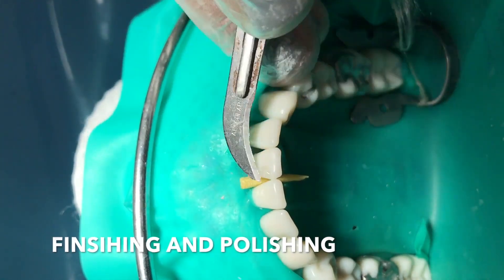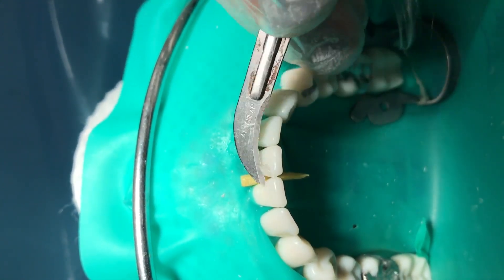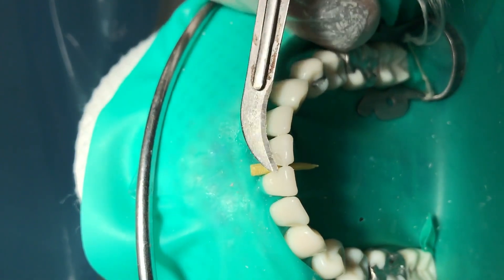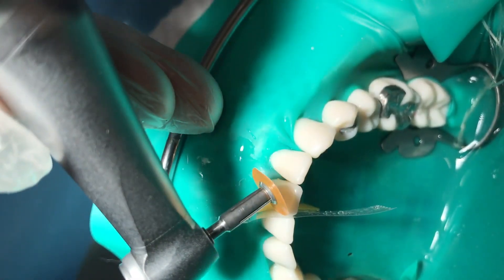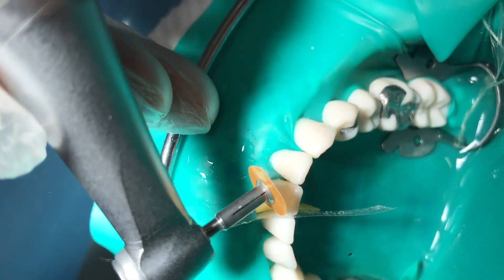After light curing, use blade number 12 to remove the excess. Make sure to direct the blade away from the gingiva. For finishing smooth surfaces, you can also use Soflex discs.